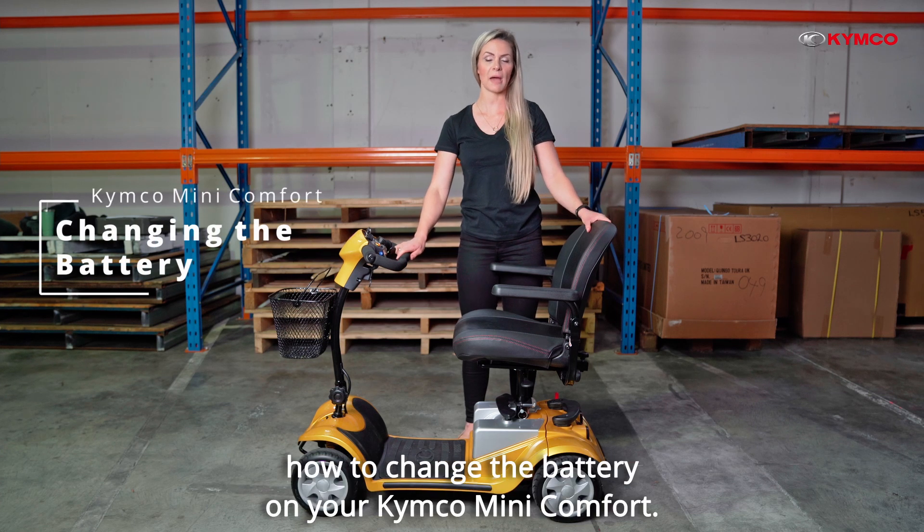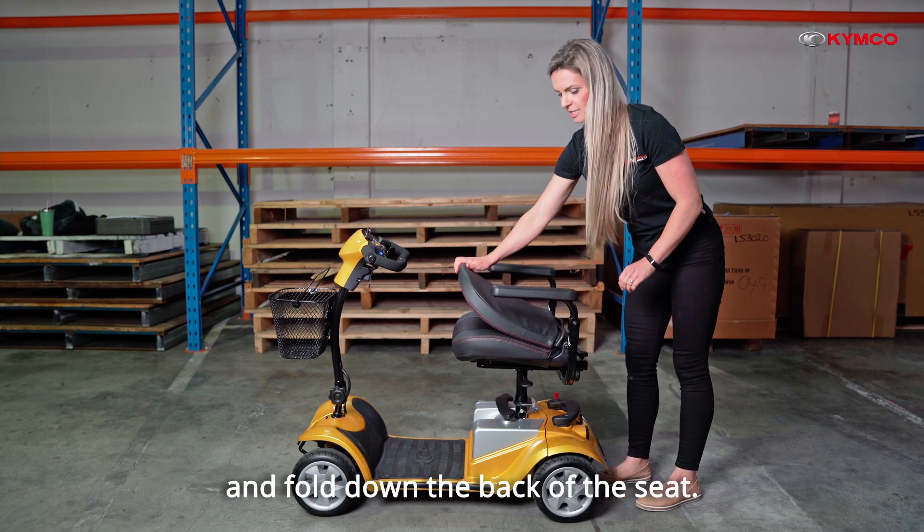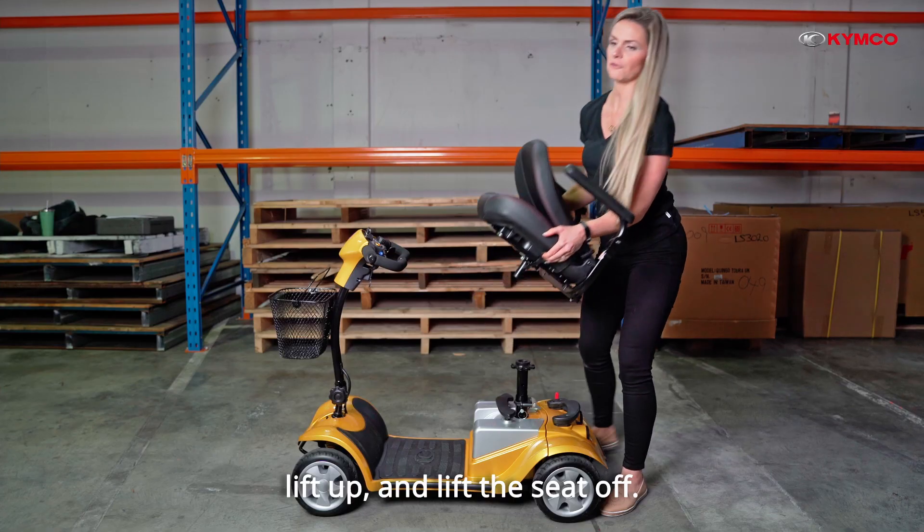In this video I'm going to show you how to change the battery on your Kymco Mini Comfort. First, come around to the back of the scooter and fold down the back of the seat. Place one hand on the lever to your left, lift up and lift the seat off.